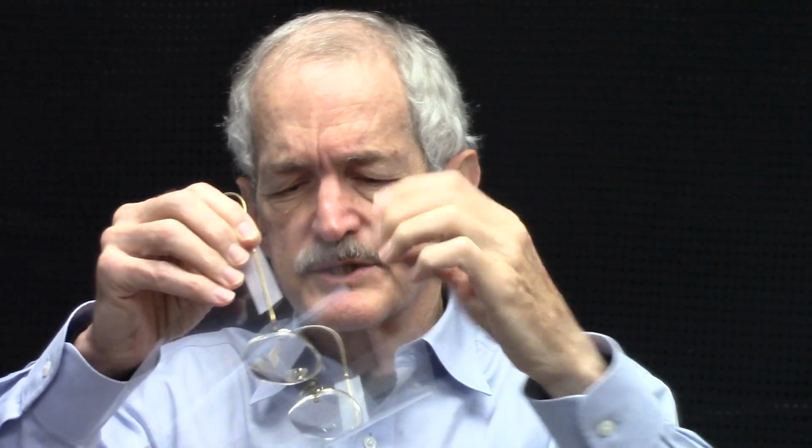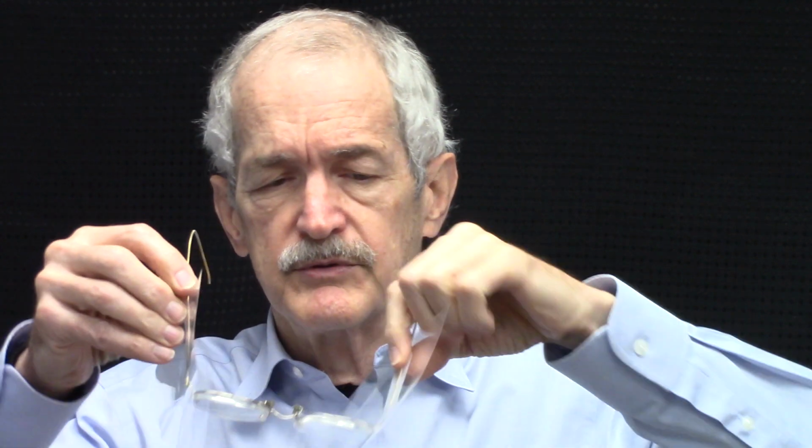Then you can see how you get excellent side protection, and you get more protection here to here than if you're with just a face mask. So then you would maybe re-secure that Scotch tape to the acetate sheet, and there's no breathing filtering like with the face mask, but this would have an opportunity to capture the mouth droplets and sneeze droplets, and maybe keep that also from somebody else's getting on your face like that.